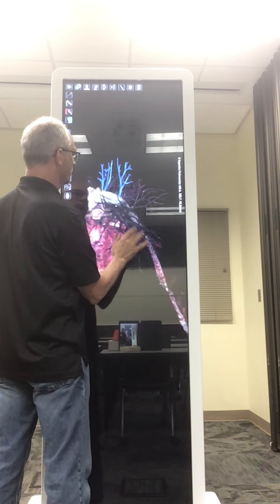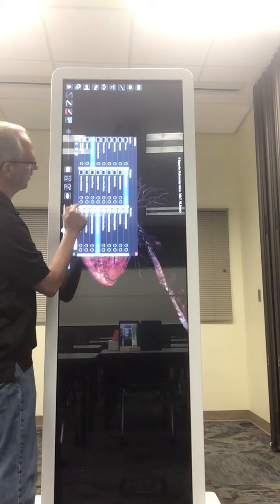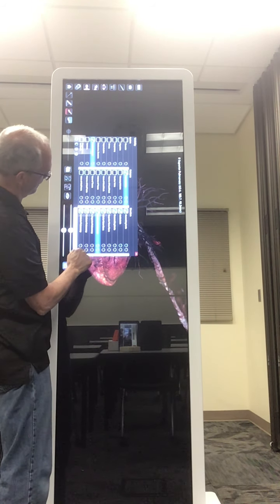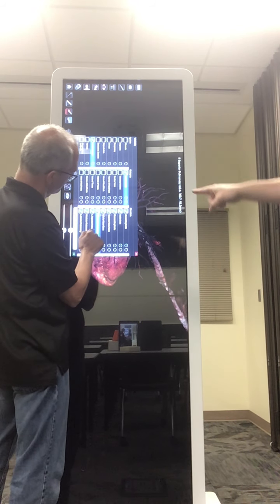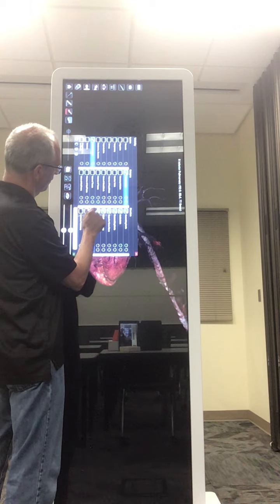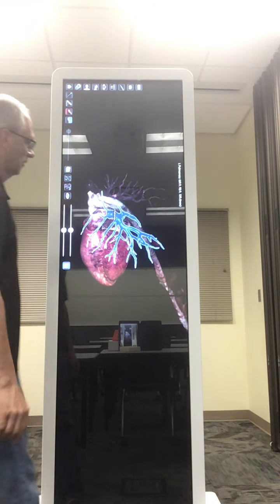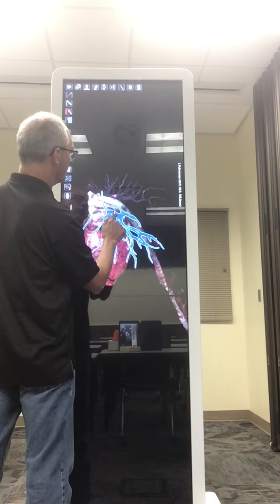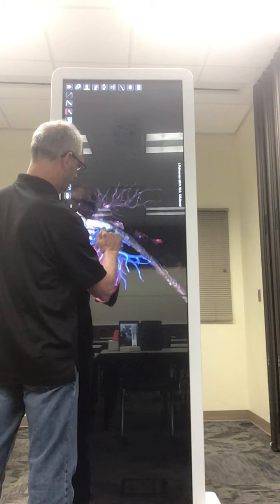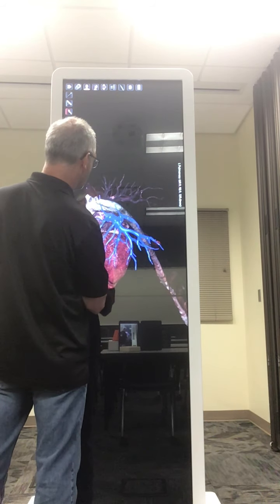Well, I'm gonna turn this around and see what we can see. If I can get rid of the pulmonary arteries. I don't think you can because they're all on there. Oh, yeah. Left inferior pulmonary, right inferior pulmonary. But I don't know, we may be, see, so what do we have here? There's a left pulmonary, that looks like it's coming up the right. Yeah, and well, it is. So that would be an artery.